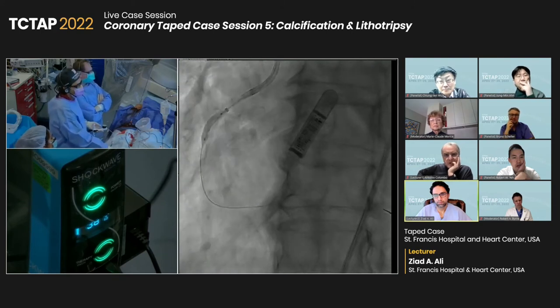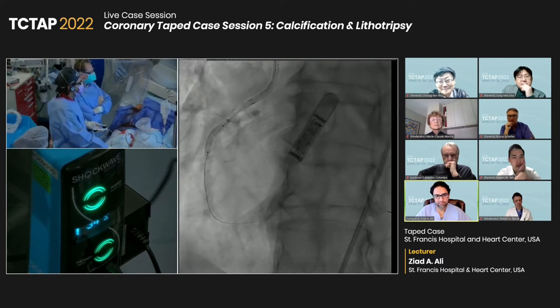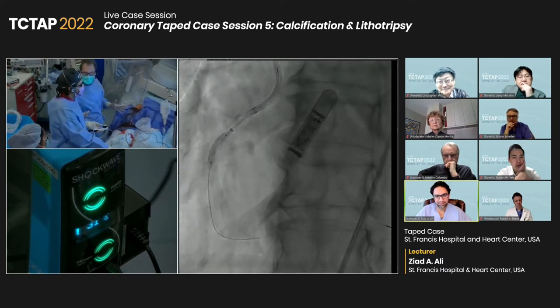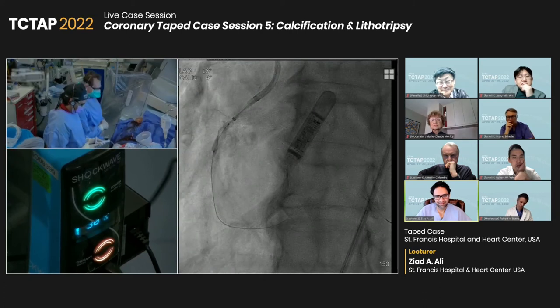Look at that prep. It's not play school. I mean, he's out of breath. He'll work 15 minutes. Look at the balloon, it's beauty. Took 8 inflations to get it. We got it. Hey, you've got to do what you've got to do. We'll take it.